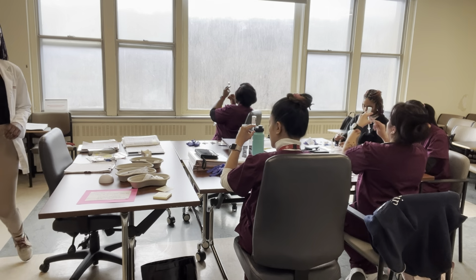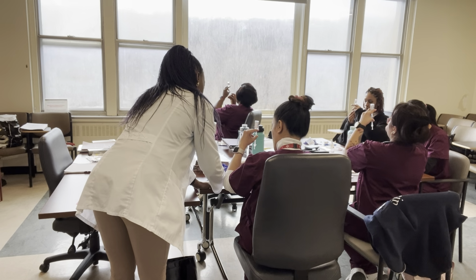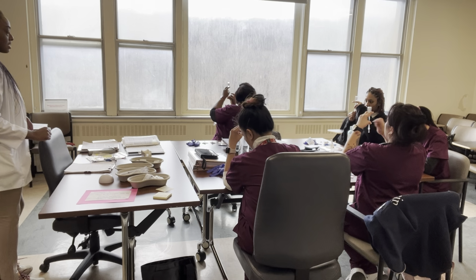Okay, we usually write things so they don't look like something else. You usually put the name of the drug first, and then the dose. Now let's see. Makes it easier.